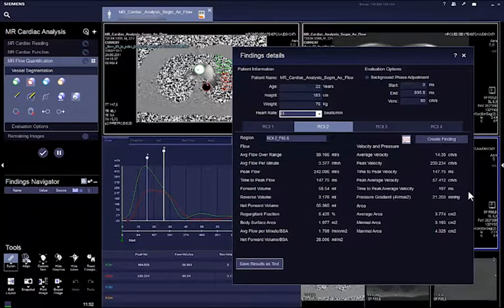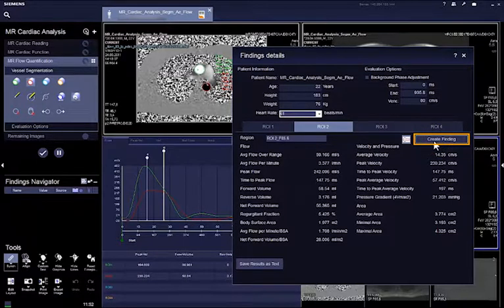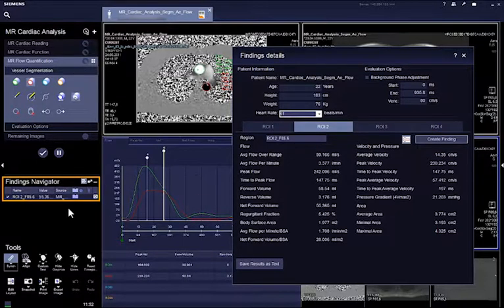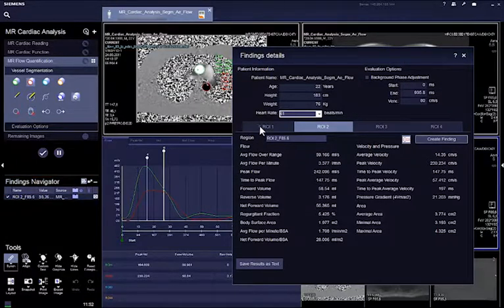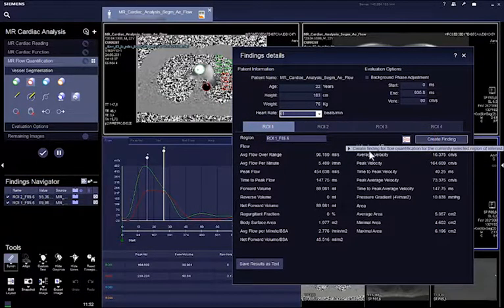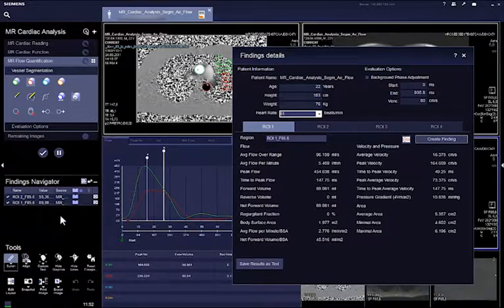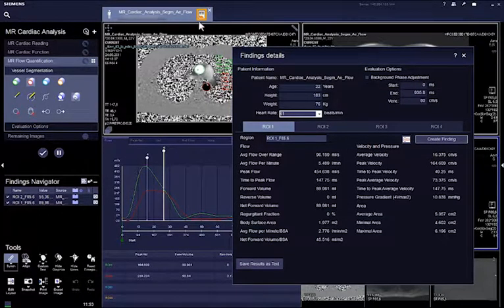Clicking on create finding will generate a finding for the selected ROI that is listed in the findings navigator. At the same time, the result is automatically added into the patient's report, which can be opened from patient tab.